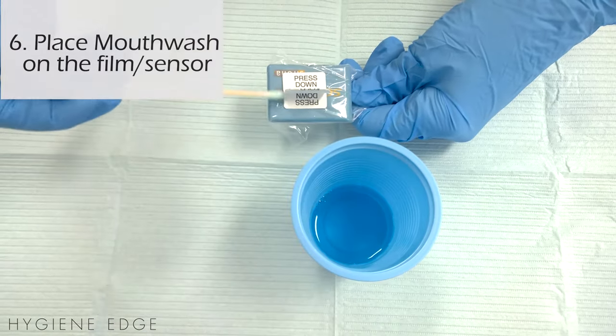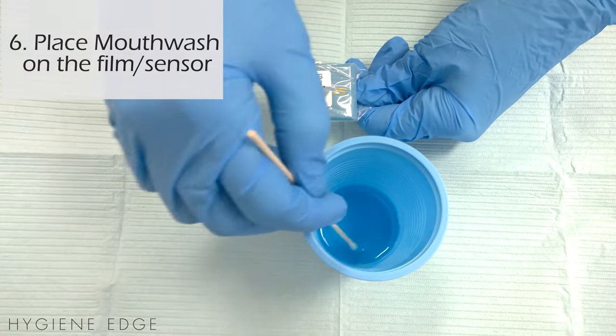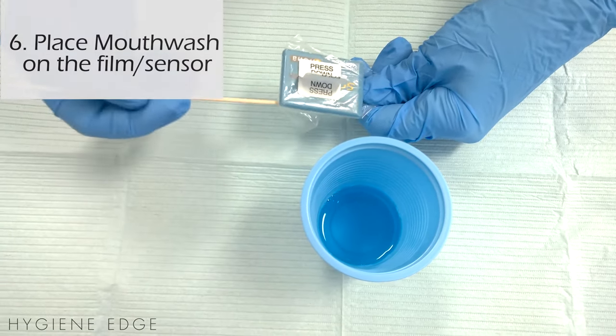Try also using mouthwash on the sensor. Sometimes just getting a new taste in the patient's mouth helps them forget about the gagging reflex.